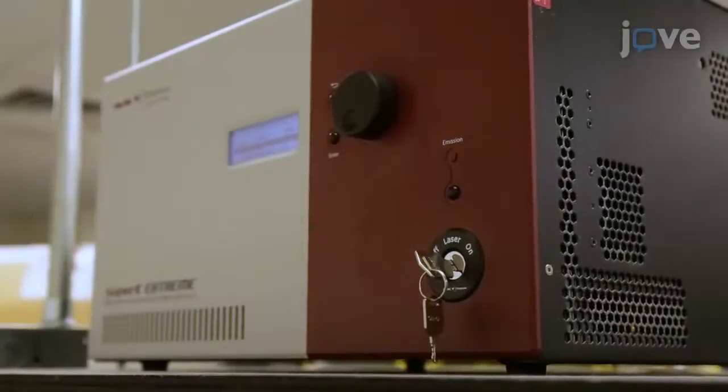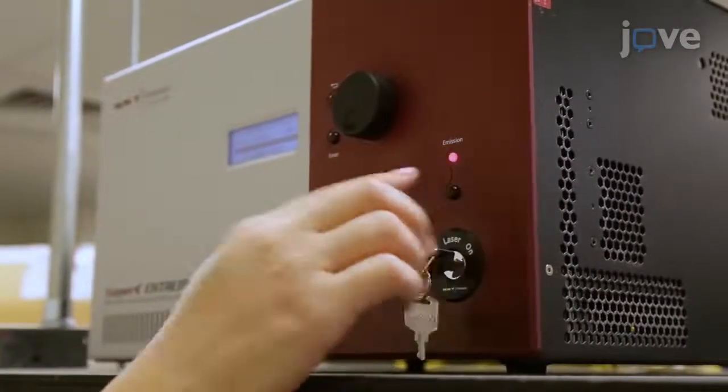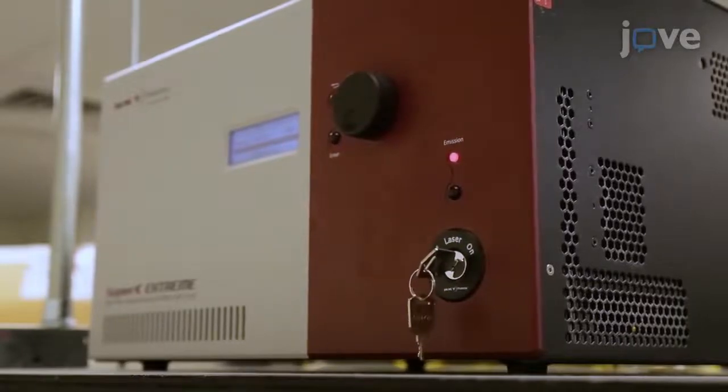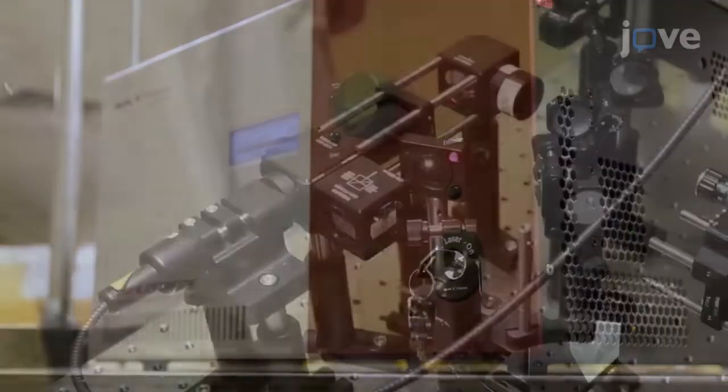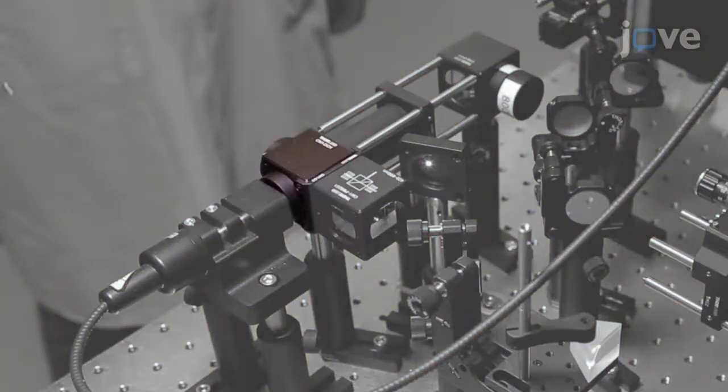A supercontinuum laser source is used as the system laser source for the oblique scanning laser ophthalmoscopy, or oSLO, setup. The visible light range is separated from higher wavelength range by the first dichroic mirror.